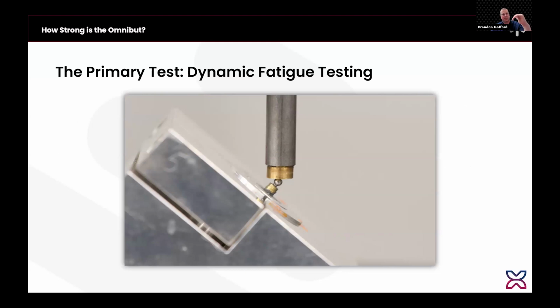onto the abutment to generate flexure in the system, right? So you have to create a fatigue curve. And then once you've established that fatigue curve, you have to dial in where you get like 4 failures and 4 passing, or forces where 4 fail and 4 pass.